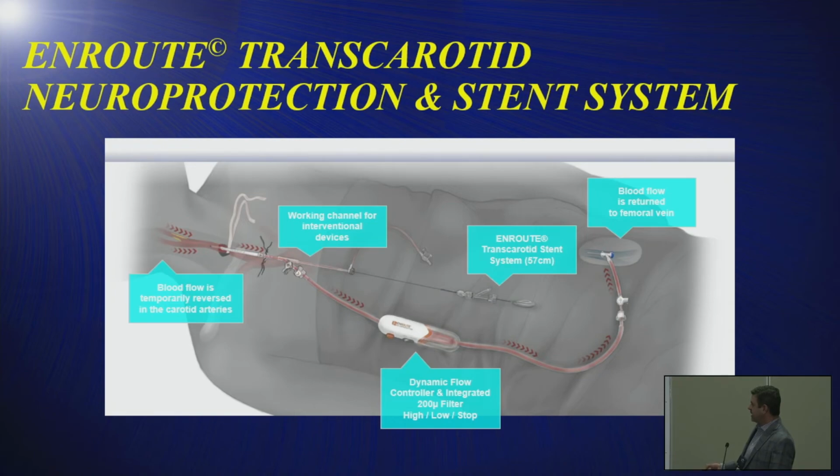There's a connector that connects that catheter to the venous system. So now you have blood pressure 120, pressure down here of 10. You're going to have normal flow towards the venous system. And so that's basically your reversal of flow from the brain through the lesion back to the system here.